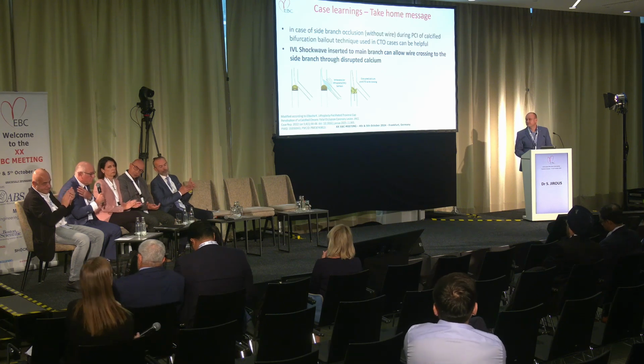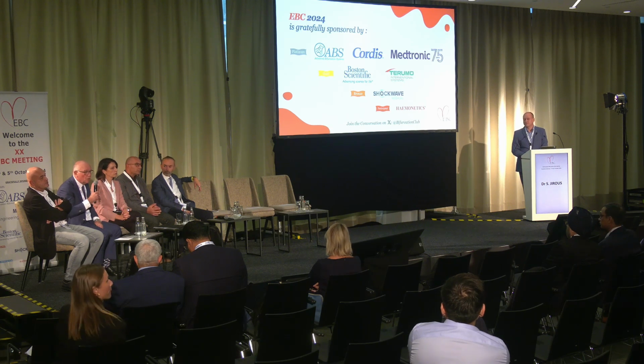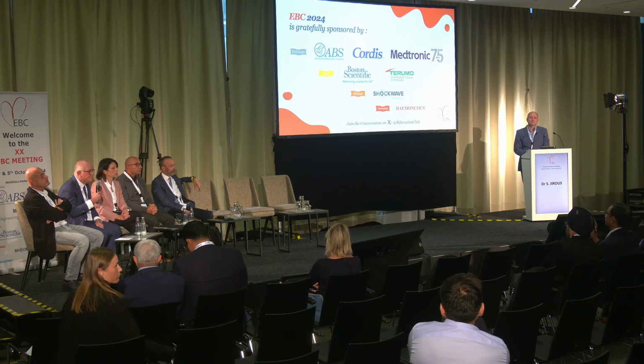Yeah, very interesting case, complex restenosis. Any questions or comments from the audience?